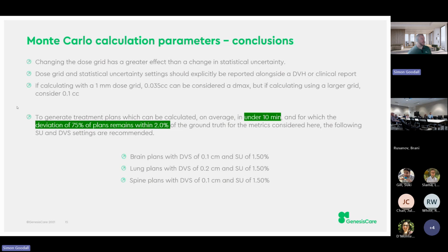I should say that this paper was published 6 years ago now, so the increased calculation speed and certainly the introduction of GPUs can massively reduce these calculation times, which can also allow us to drive past these. So these really probably should be considered worst case scenarios right now, I think, in current clinical practice.